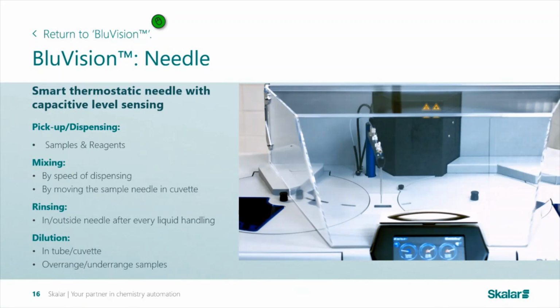Of course, the needle is also responsible for all of the dilutions together with the pumps. And just a quick point on the dilutions here. On the Bluvision, it is possible to perform dilutions in both the cuvette and a sample tube, and that actually offers great flexibility over a much wider dilution range, because dilutions of up to 1,000 times can be carried out in a sample tube in a single step, and in the cuvette a 200-fold dilution can also be done.